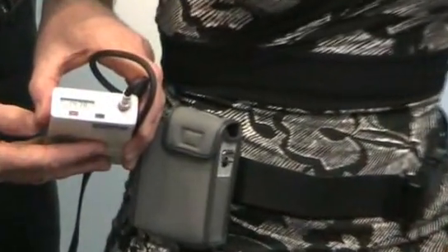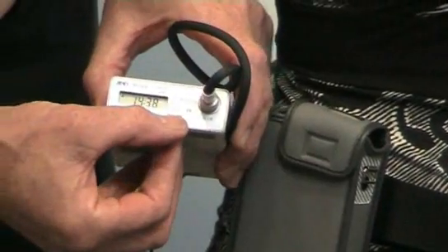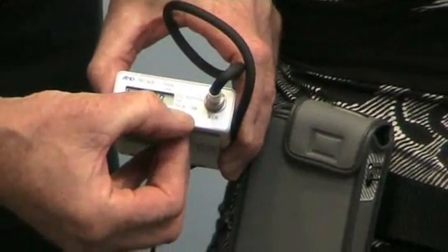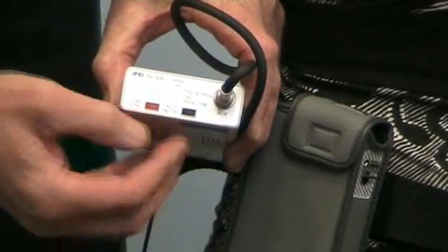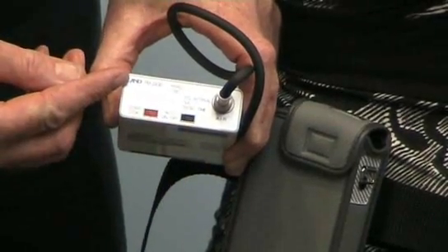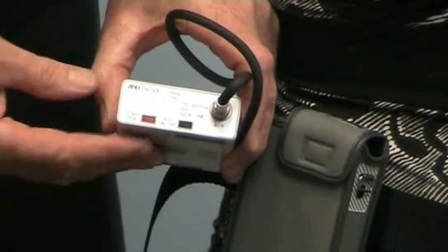We have a time setting on the unit here. To put this into automatic mode, just press the black button down and hold for about four seconds. The second beep sounds and an 'A' appears in the top left hand corner of the LCD, indicating it is now in automatic mode.